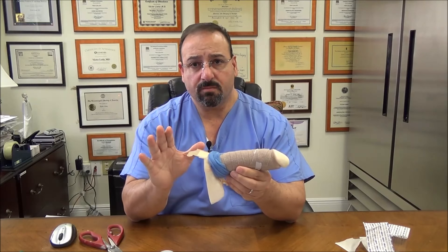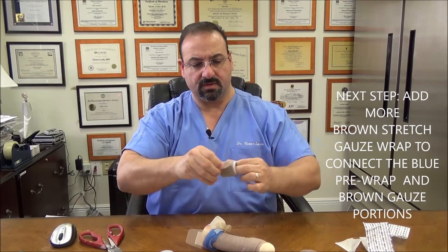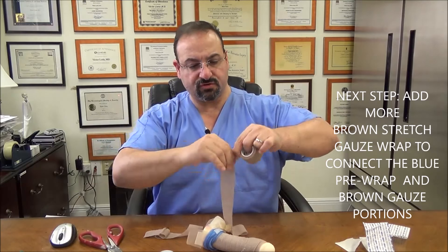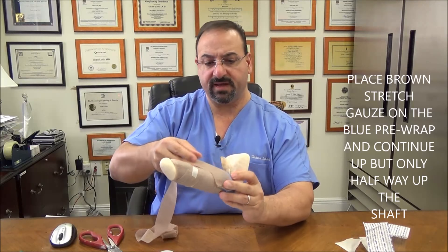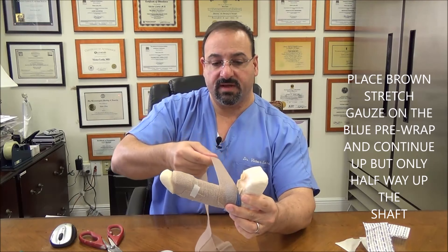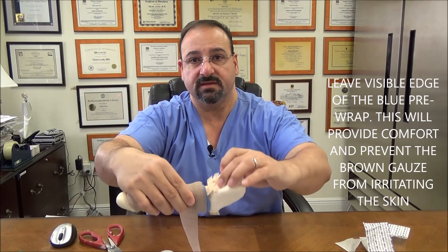Now what you want to do is add a little more brown stretch gauze to connect these two pieces so there's no joint space opening. Let's open a new roll. This brown stretch gauze only goes a little bit — about halfway up. You want to put the brown on top of the blue, that's where you're going to start. This band-aid should stick better here. Work your way and notice I'm going to leave a visible edge of blue — see that little blue edge.